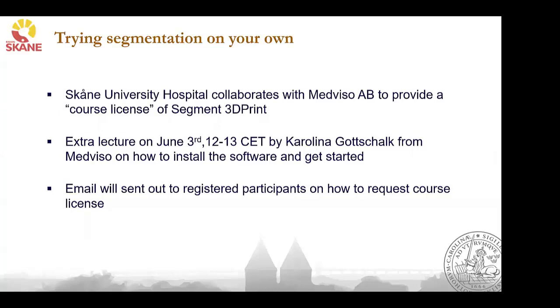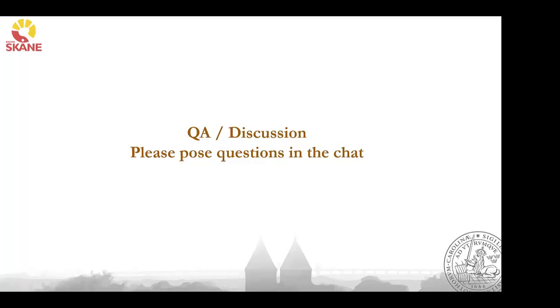Yeah, there was a question from Prashant Ray. Any experience with PMMA molds? Yes, I mean the bone cement that we talked about today, I think it's the same as PMMA. So all the molds that we've been doing are basically PMMA. The plastic name is Palacos, but chemically it's basically PMMA, if I'm not mistaken.